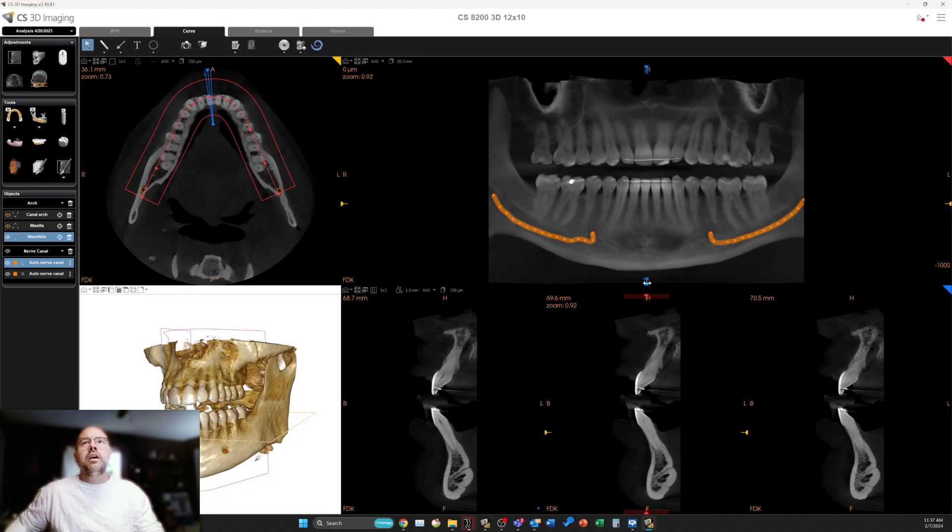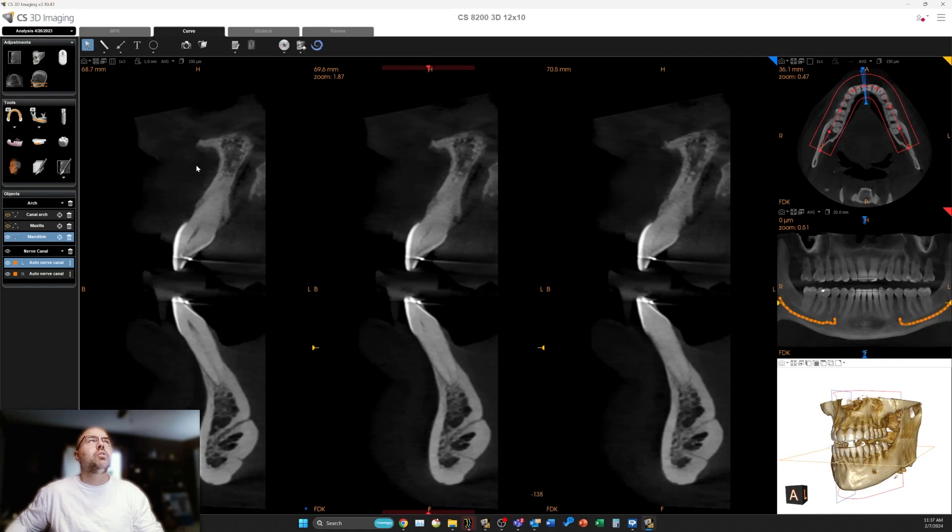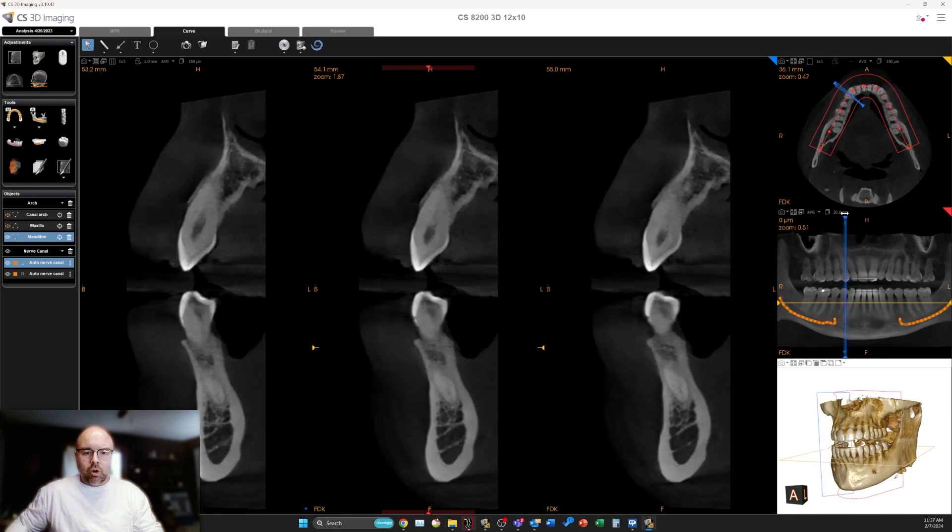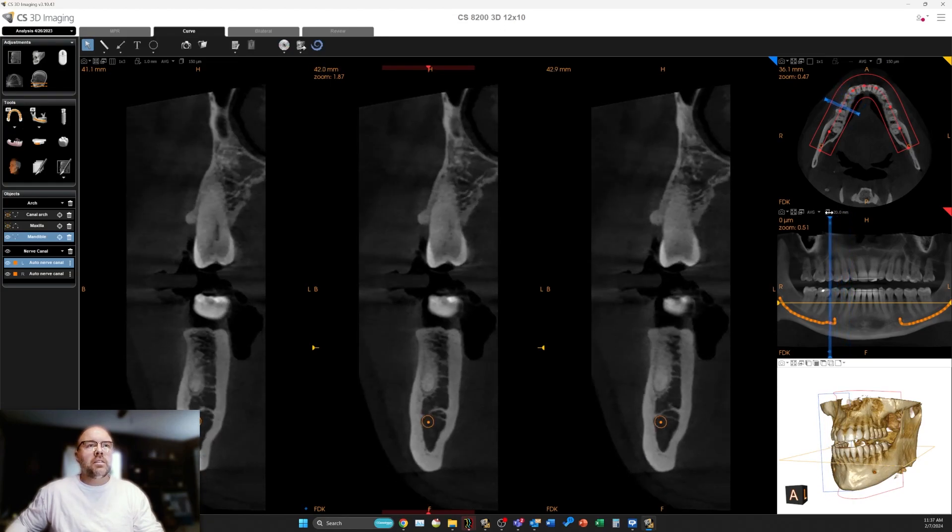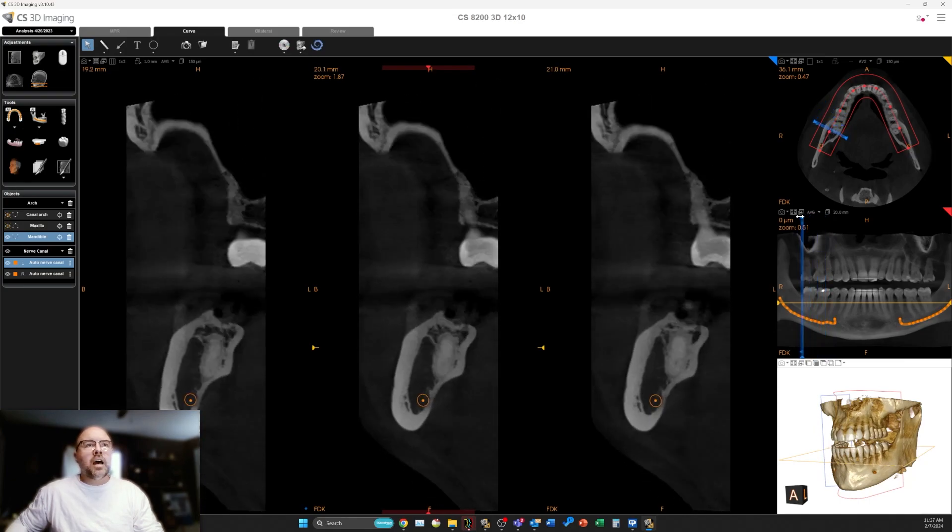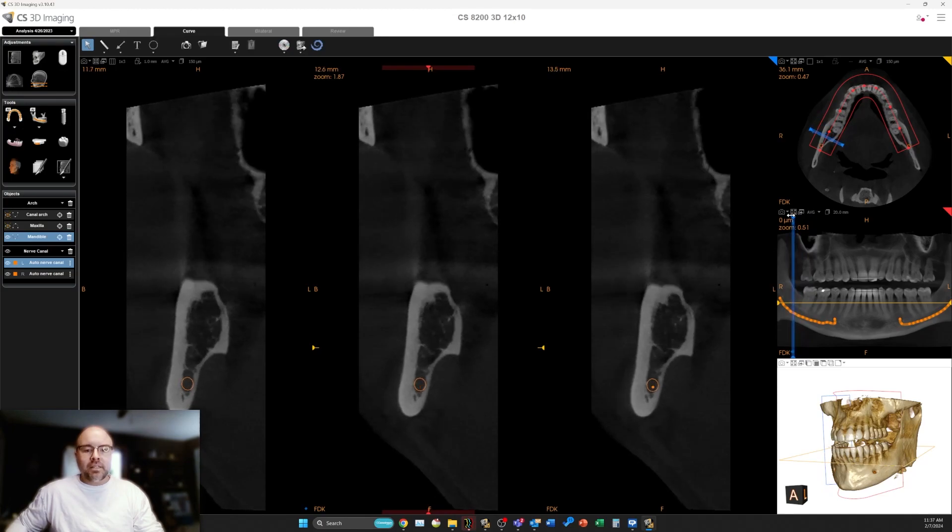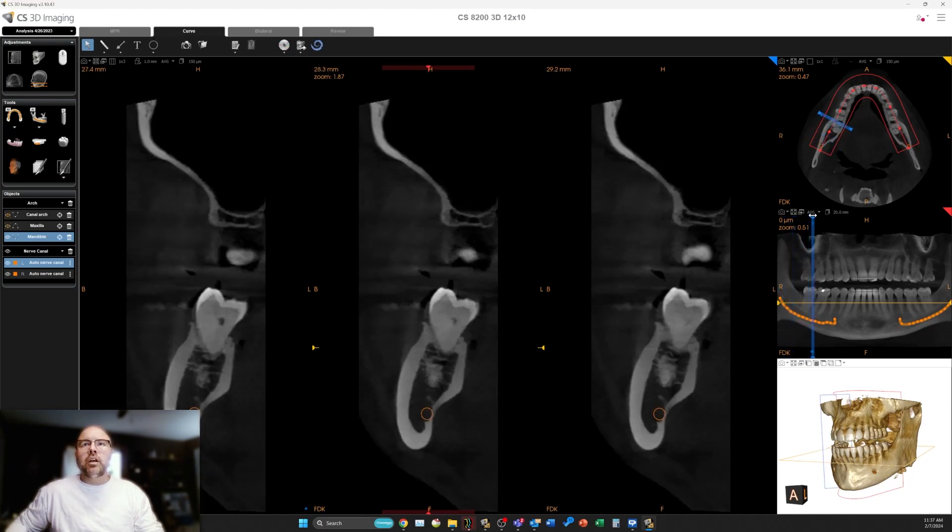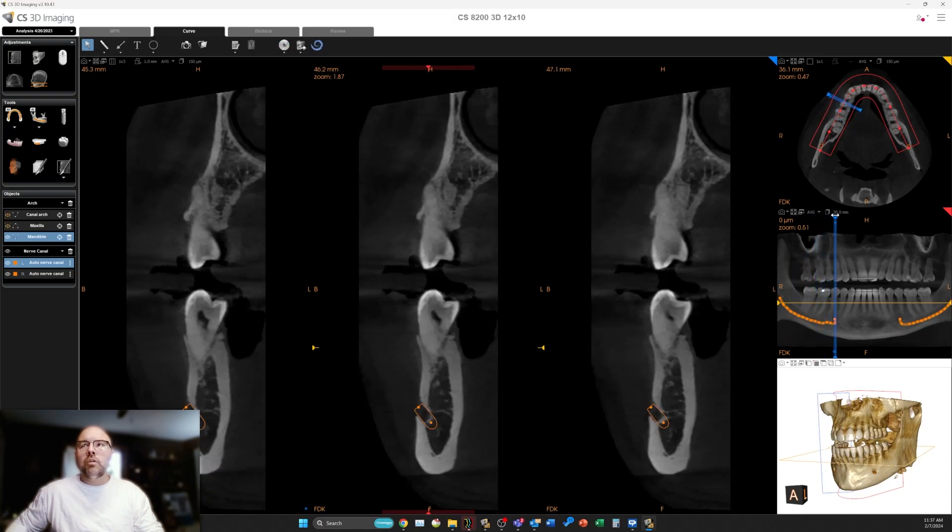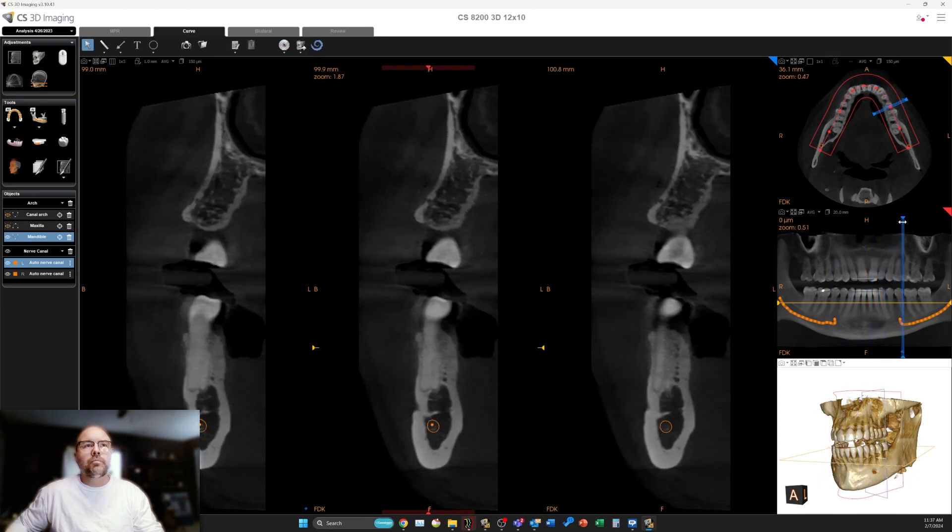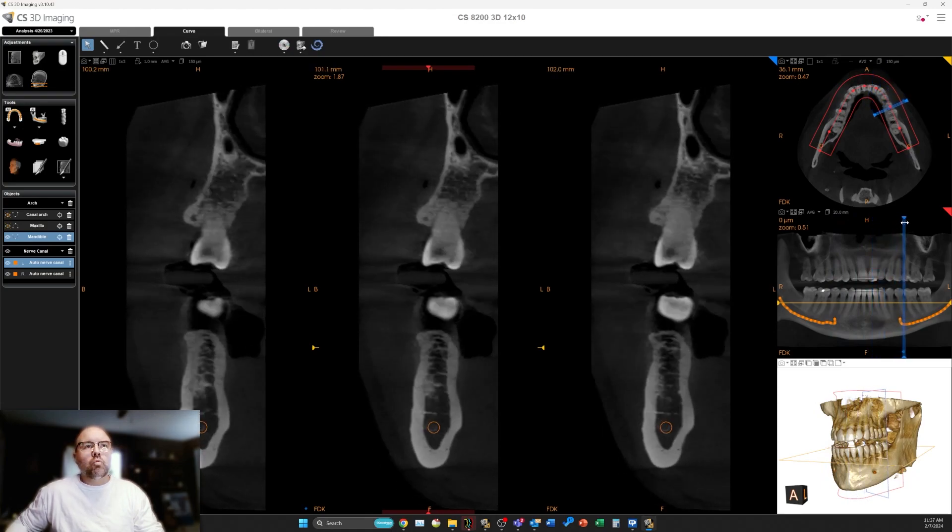It did switch us back over to the mandibular arch. Now I'm going to use the transaxial view to verify the placement of this arch. We're going to start off on the right side. I expanded the transaxial view. We're going to use that blue slider, the movement handle, to go right over where that nerve tracing is. We can see that although there's not a ton of density in the bone, the AI nerve tracing did a great job of mapping that nerve out right where it's supposed to be.